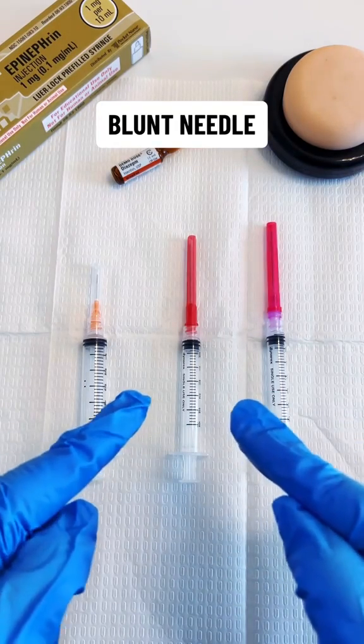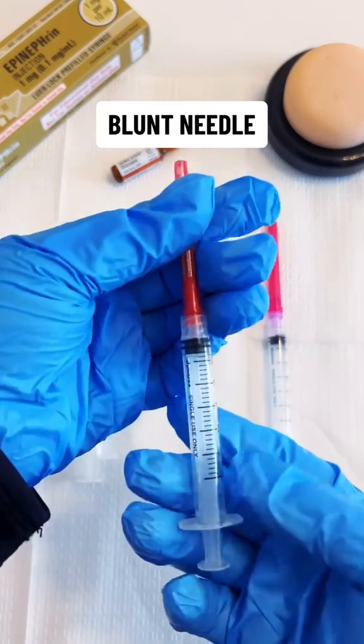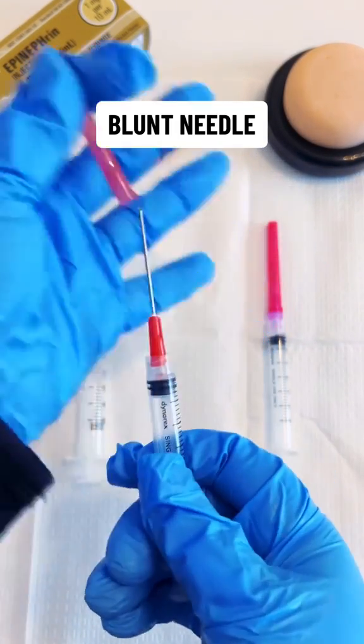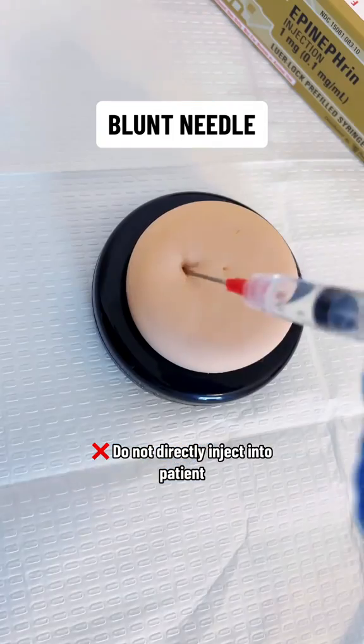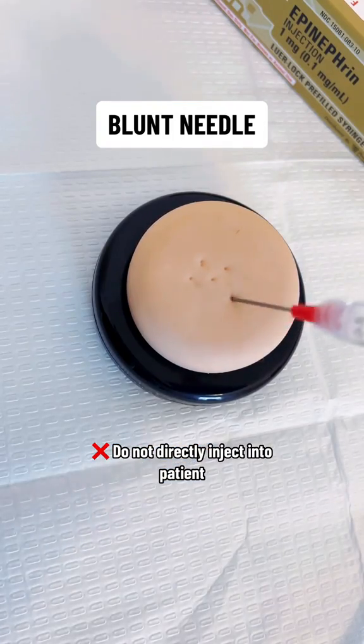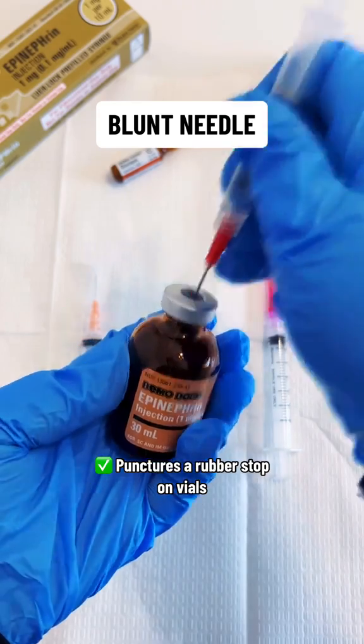The next type of needle is a blunt needle without the filter. Just remember it has that distinctive red cap and red hub. It's again a flat tip or unbeveled, so you don't want to inject this into your patient. This can be used instead to puncture a vial rubber stop on a medication.